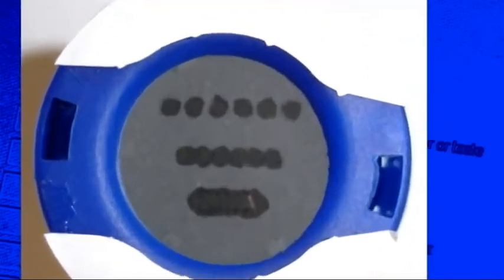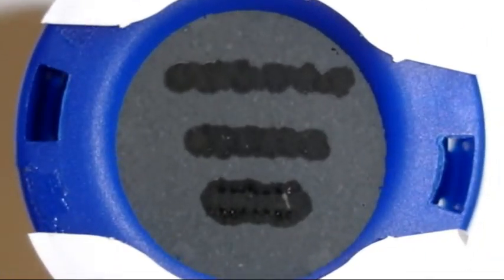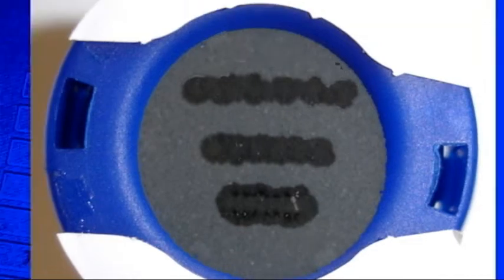On the third picture, both the bottom and middle rows have formed into continuous lines, so the concentration is greater than 0.5 but less than 1.0 mg per cubic metre — a failure for a breathing air test. On the final picture, all three rows have formed continuous lines, and the concentration level is now in excess of 1.0 mg per cubic metre — once again a failure for a breathing air test.